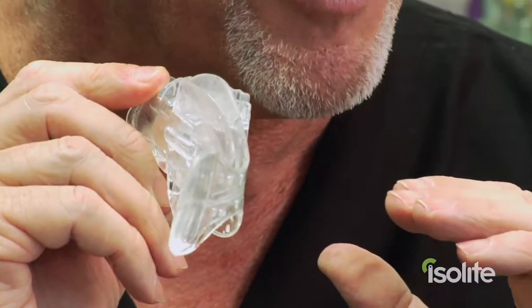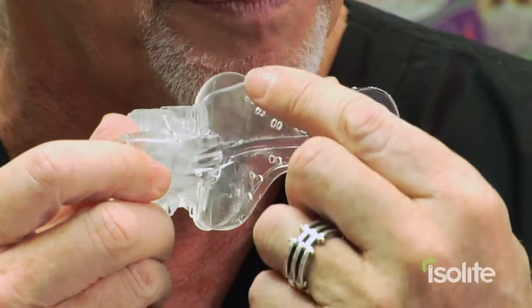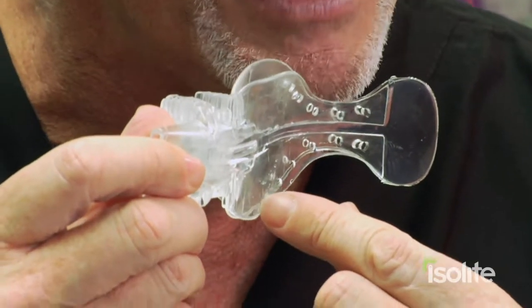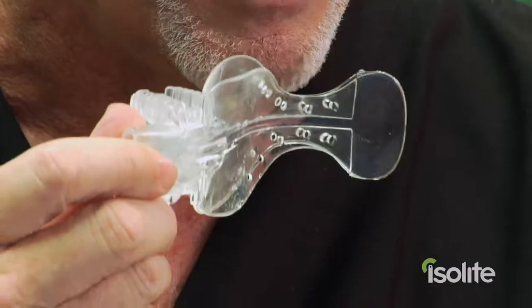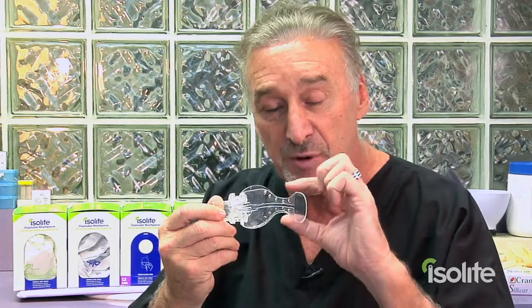When the patient is locked into position and can't move their mouth at all, that becomes a problem. The second part is the tongue protector, which is this oval-shaped part right here. This keeps the tongue protected and out of the way of the handpiece or the dental drill. The worst thing you want to do is cut a tongue — but with this tongue protector, it will literally be impossible to cut a patient's tongue.